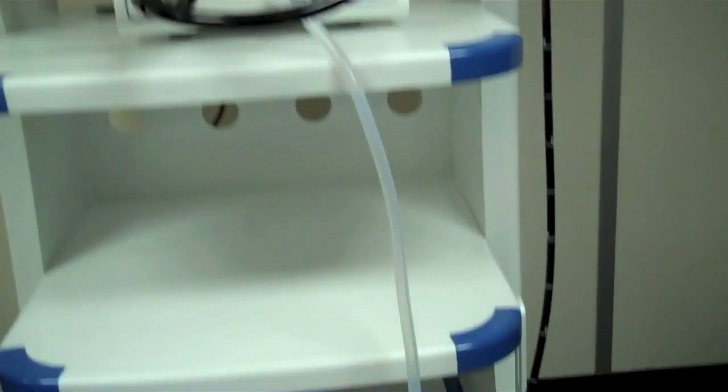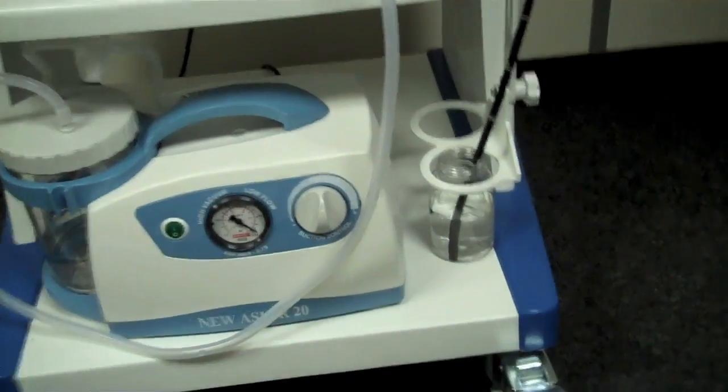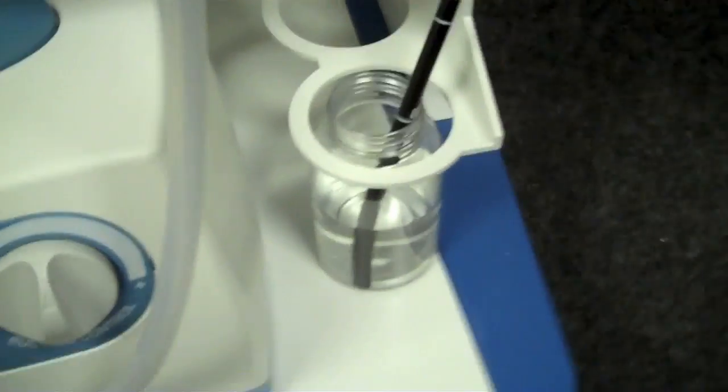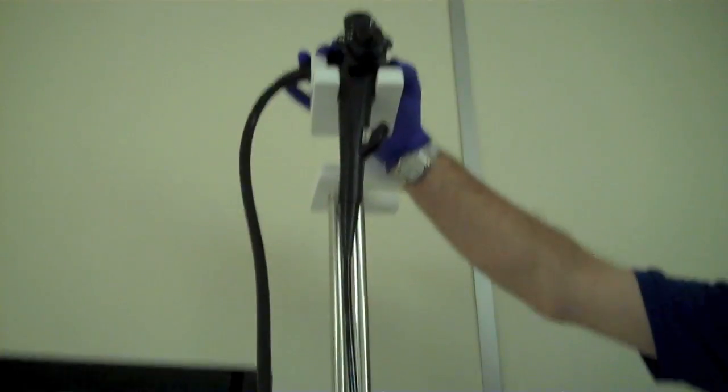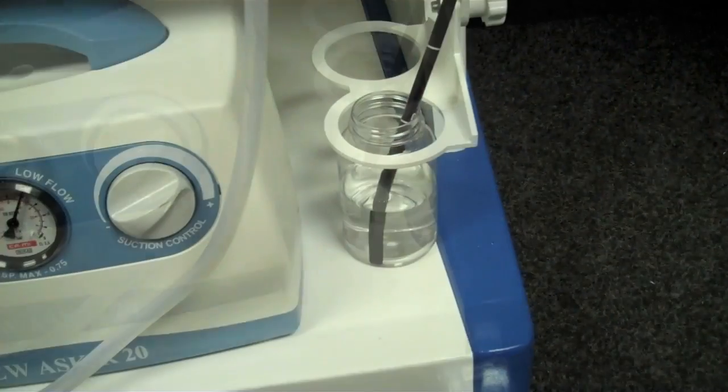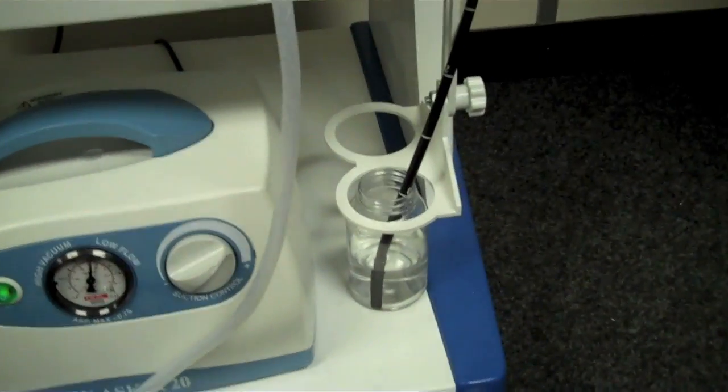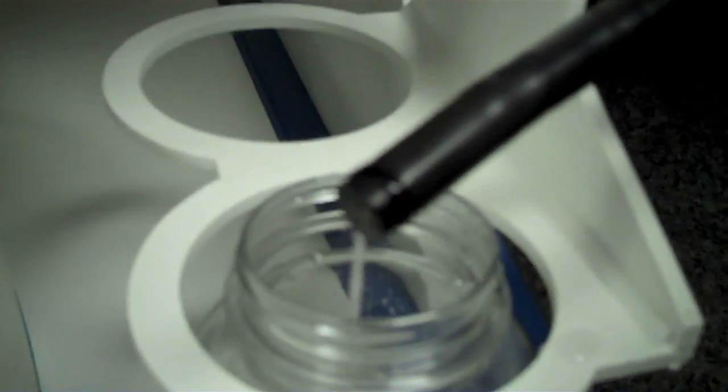Once the endoscope has been used, put it back on the cart like this and put some clean water solution in this tube. We're just going to suck this through. Now we'll just suck through a quantity of water to help clean the working channel. Now just aspirate a bit of liquid through the air water channel.